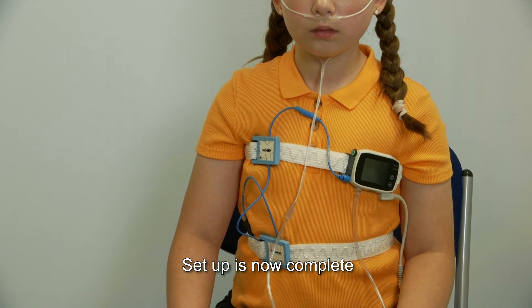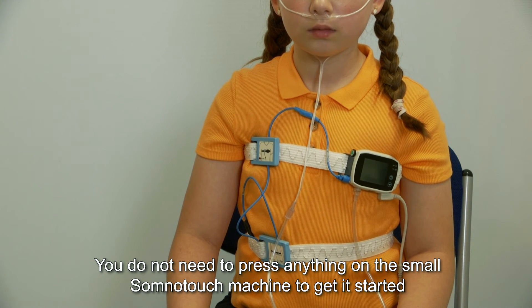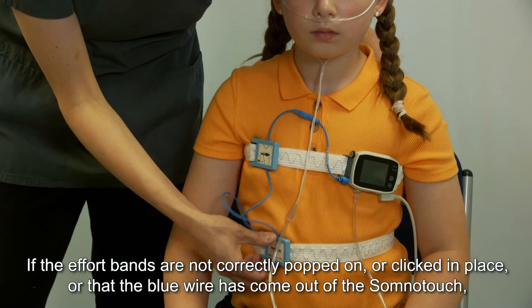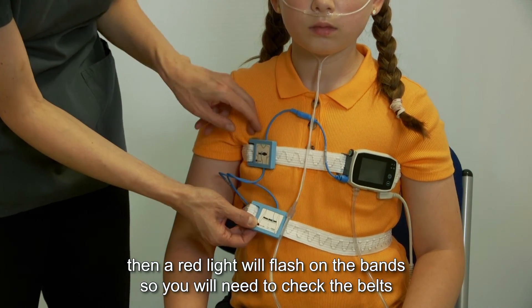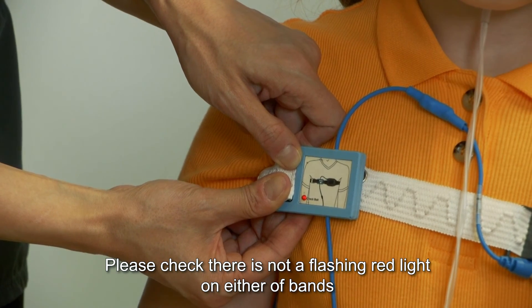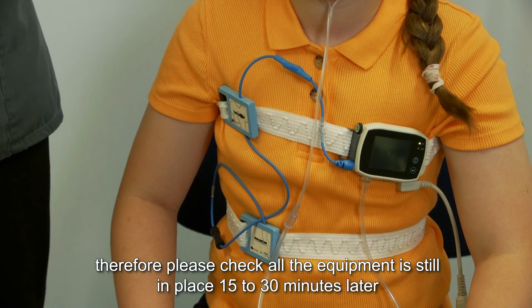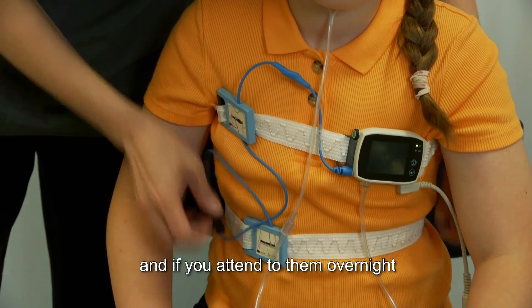Setup is now complete. Important things to know and check: the machine is set up automatically to start recording — you do not need to press anything on the SomnoTouch to get it started. If the effort bands are not correctly popped on, or if the blue wire has come out of the SomnoTouch, a red light will flash on the bands, so please check that there is no flashing light on either band. Children are often more restless at the start of their sleep, so please check all equipment is still in place 15 to 30 minutes later and if you attend to them overnight.